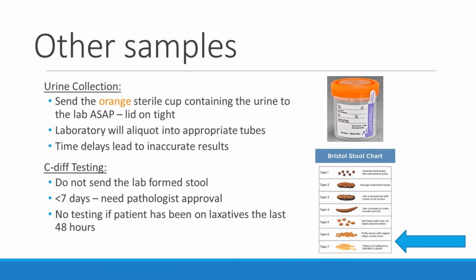And then C. diff testing. Don't send us formed stool. It should not be hard. You shouldn't hear it when you shake a cup. It really should be Bristol stool chart type 6 or 7. And no testing if the patient has been on laxatives the last 48 hours.